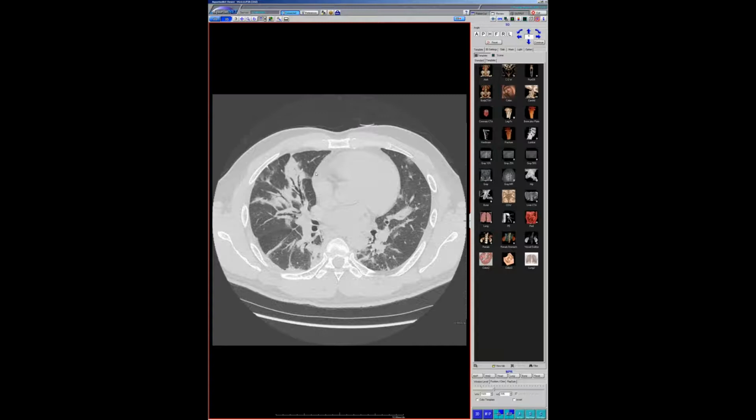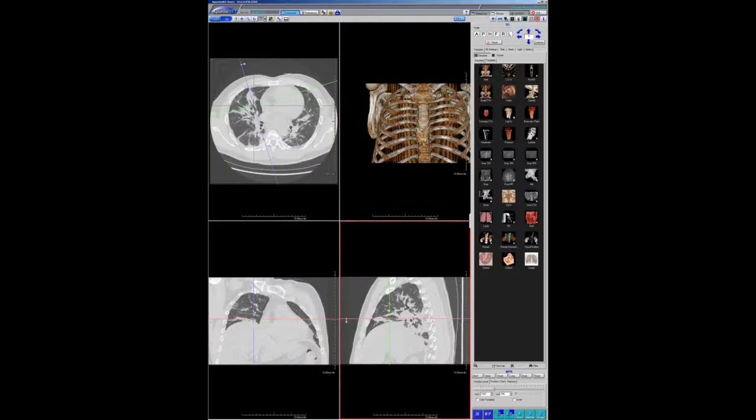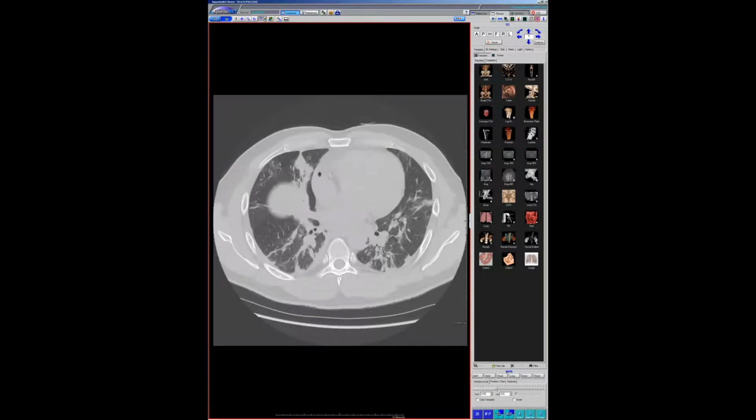I think that's part of it, and I think the other thing is that a lot of the cases I'm seeing are in old people. This guy's 40. Yeah, so I think it may be different in old people, and may look denser and stuff like that, and look more like a bacterial pneumonia, maybe because of age. So I think it's what time we're getting the imaging, how old the patient is, and what sort of immune response the person is generating. So I think it's both things, Jeff. Okay. Yeah. And I think a lot of it is when we're getting the imaging. Again, this guy was probably sick for a week or so.